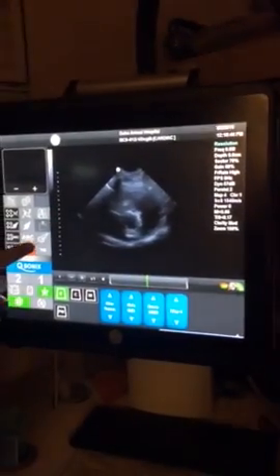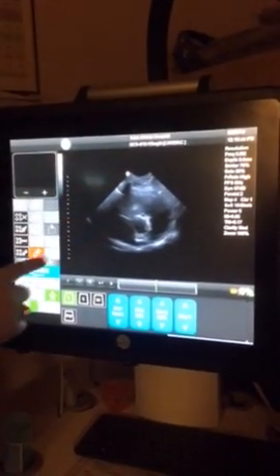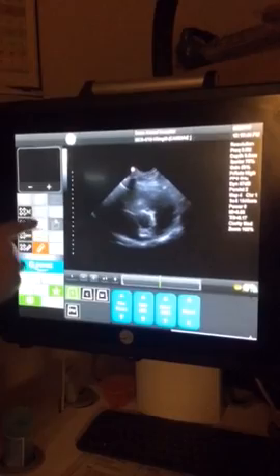Okay, so for the patient we did, which is Monkey, we're going to go back in there and find that and say that we didn't do any measurements. Okay. So we're going to hit our people. We'll find Monkey. We're going to hit Monkey there.